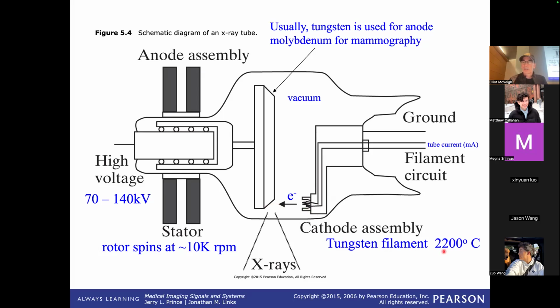So this is also at a very high temperature, this filament, when it's being run up. This is why when you get on a CT scanner, normally the procedure is before I scan a patient, I run this tube a few times, just warm it up, right? Get this cathode warmed up, get this thing warmed up so everything comes into a stable configuration, right?